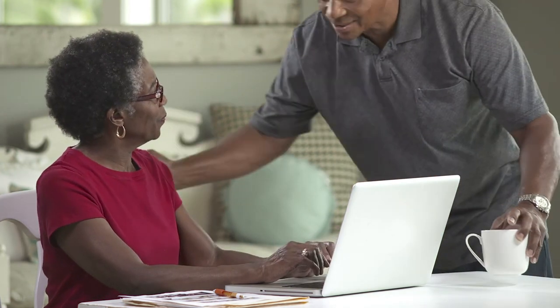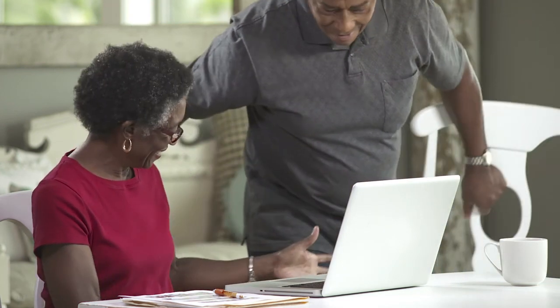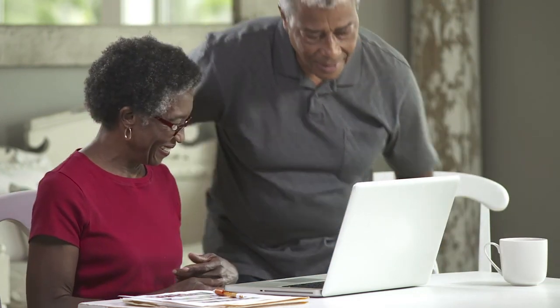Be sure to read the full instructions for use that come with the PleurX drainage kits before you drain. The instructions also include answers to frequently asked questions. If it is an option for you, consider asking a family member or caregiver to learn how to assist you with the procedure. It may be easier with an extra set of hands, although it is not necessary.